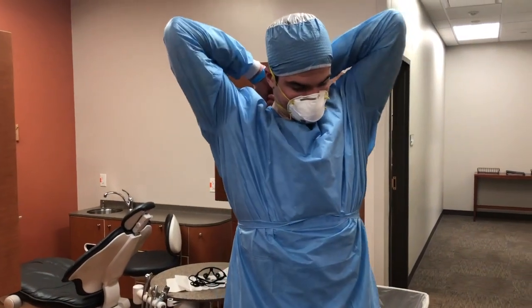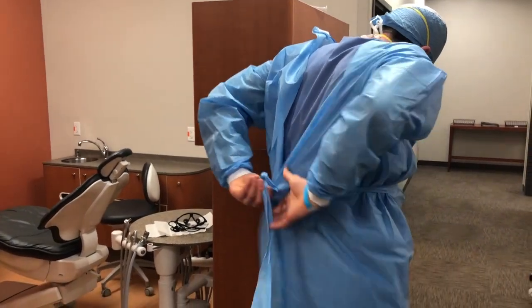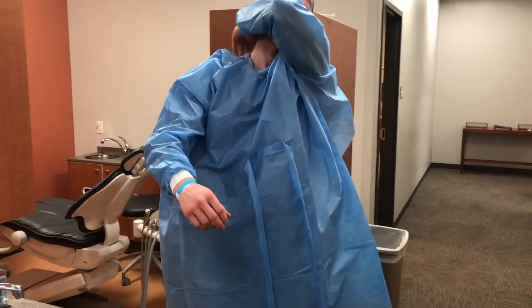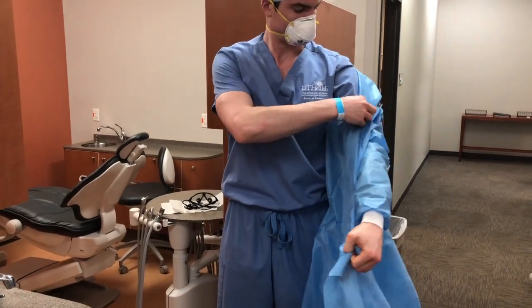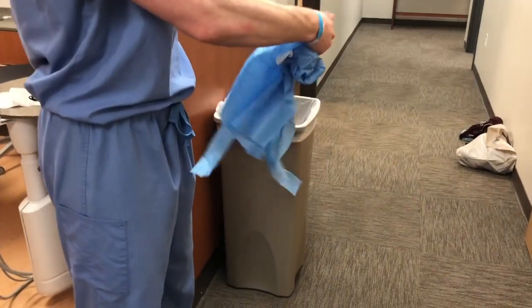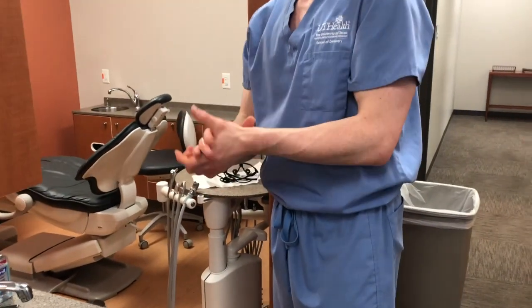Perform hand hygiene again. Now you're going to remove the gown — untie the gown at the neck and at the waist and peel the gown off from the shoulders without touching the front of the gown. If done correctly, the sleeves should turn inside out. Roll the gown touching only the inner aspect of it and discard it. Perform hand hygiene again.